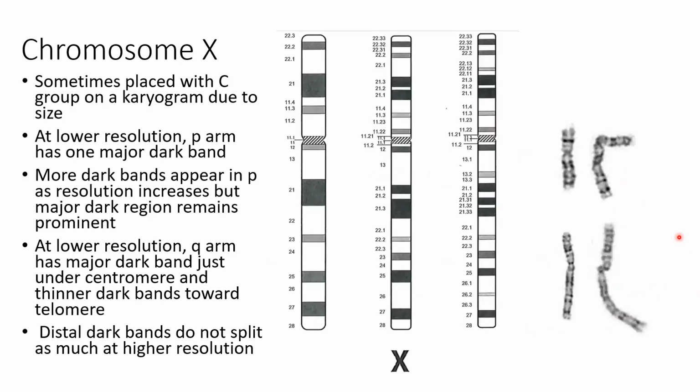Okay, and then the X. X is often misplaced, especially when you're just learning your chromosomes. So, expect that to happen, but I think you'll get to where it will be fine. You'll be able to recognize an X from an 8. Often I see an X misplaced, turned upside down, and especially on some banded preps that are not great, it can look a little bit like 8P.